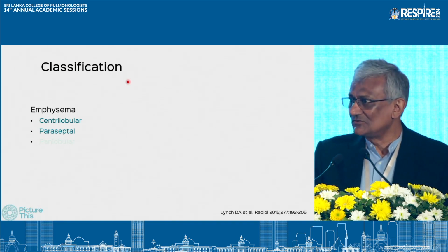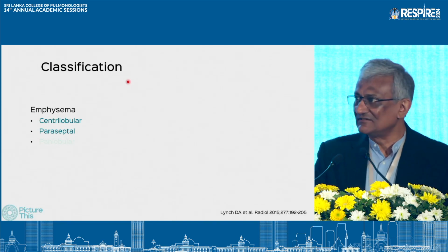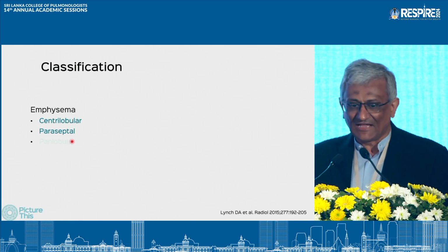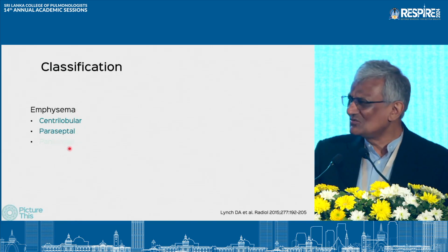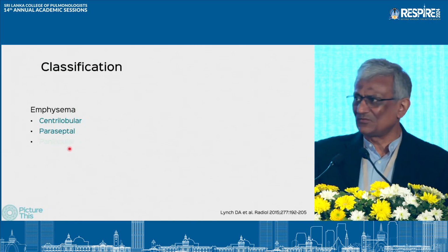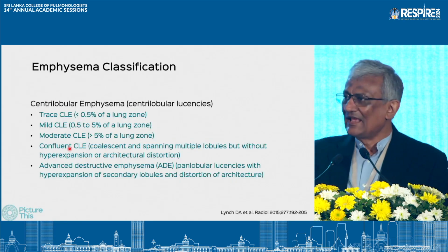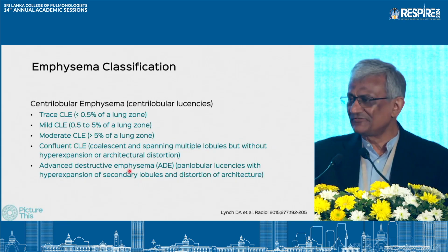We move on to emphysema and small airways disease, where CT is gradually playing a larger and larger role in understanding the disease phenotypes. And while we have three major anatomic subtypes, we don't see panlobular, at least where I practice, and so we will stick to centrilobular and paraseptal. And in 2015, Dr.